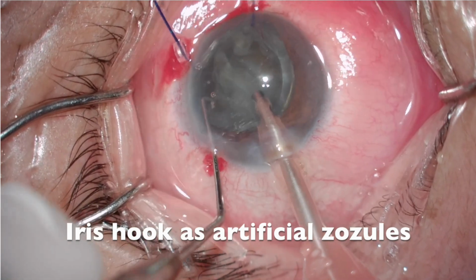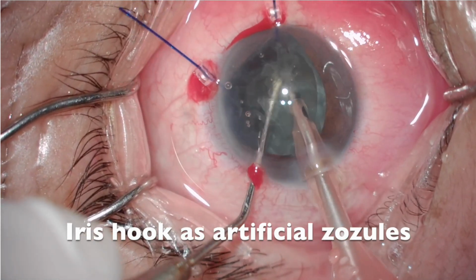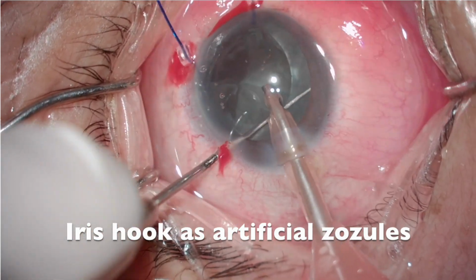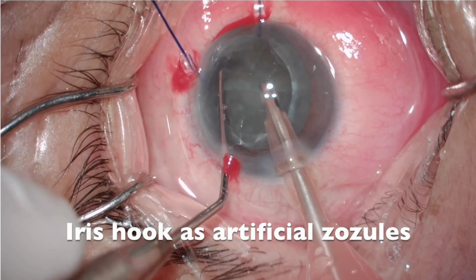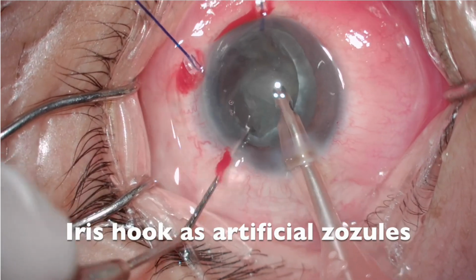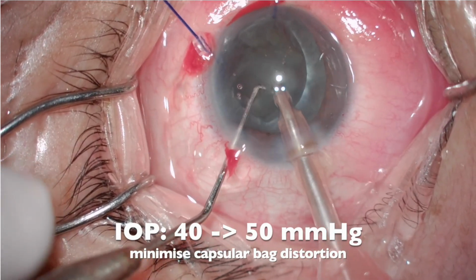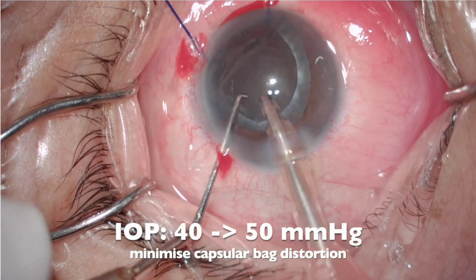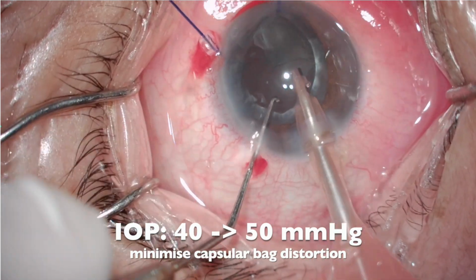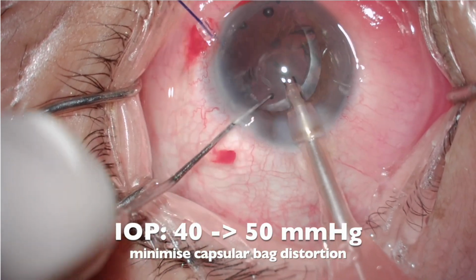The iris retractor behaves as artificial zonules. It provides a counter force. I keep the phaco tip in the central safety zone. Minimize force on dialysis zonules. More stability and efficiency through this system is important to manage a zonular dialysis case. Perform phacoemulsification smoothly in the first 2 quadrants. Elevate IOP from 40 to 50 mmHg for the last 2 quadrants to minimize capsular bag distortion.